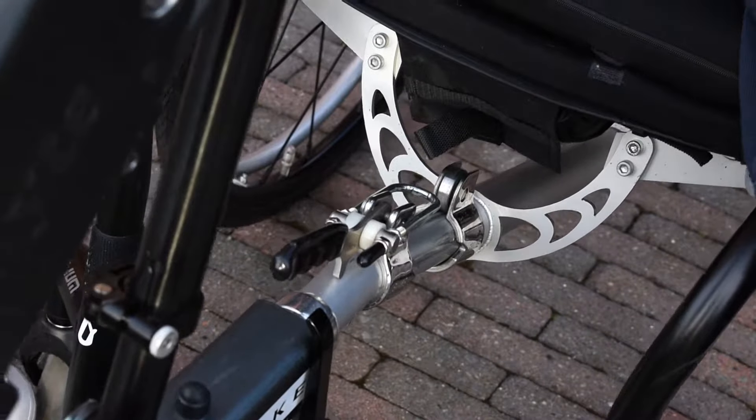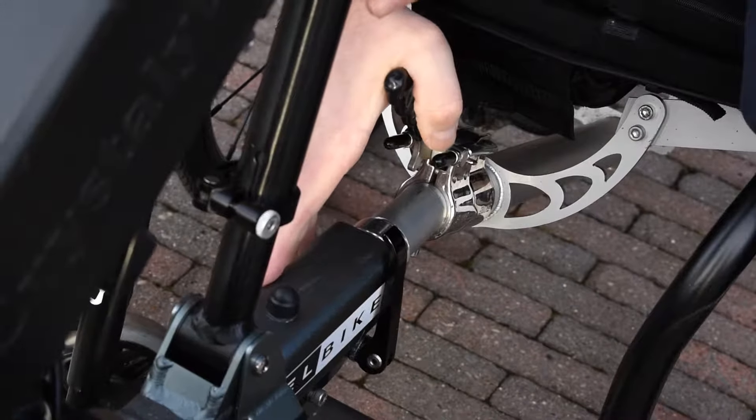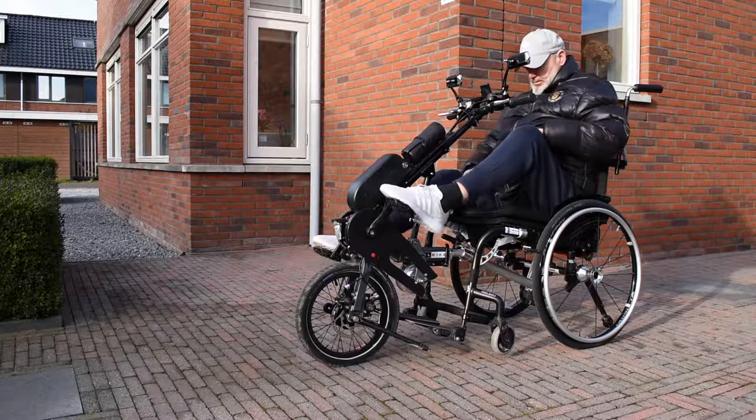Walking is a very complex movement, in which at certain moments the whole body weight balances on one leg. It's therefore not surprising that many people, due to a disorder, need a wheelchair.